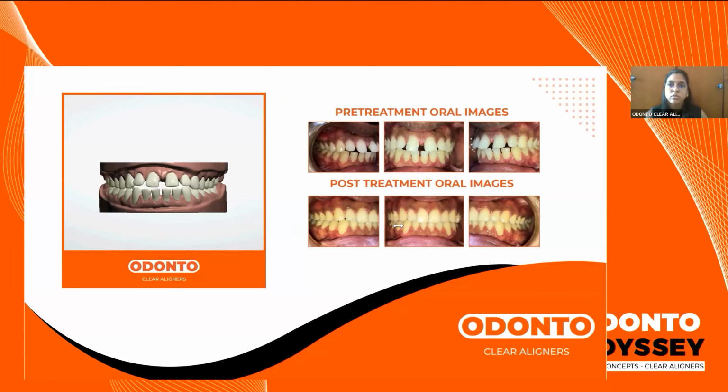Strauss has good quality burrs. You can go in for those. They have either a kit or you can buy those burrs individually. You can always check with them in terms of how it works out. Those are better. You also need a range of burr dimensions, as the dimensions are based on the amount of proximal reduction that is required.